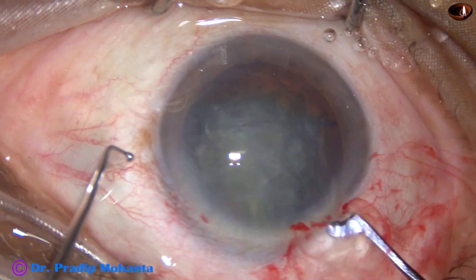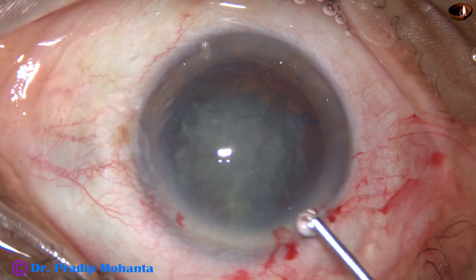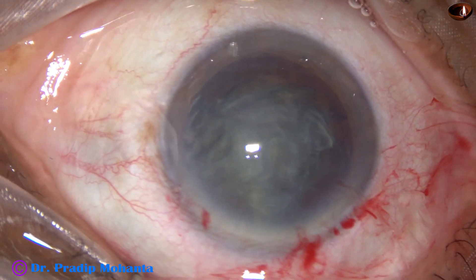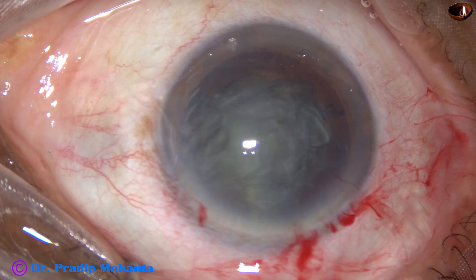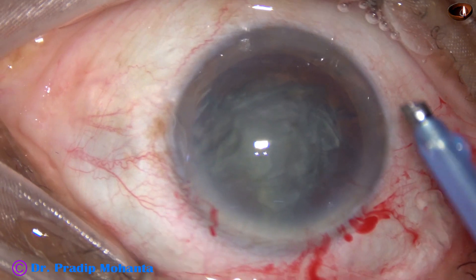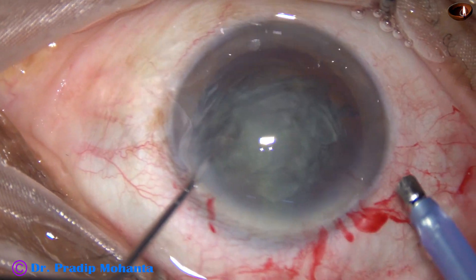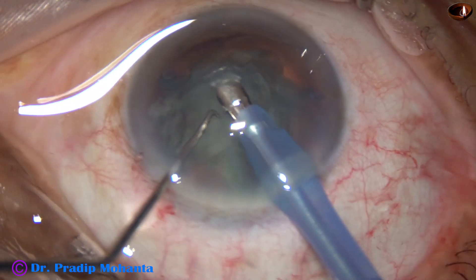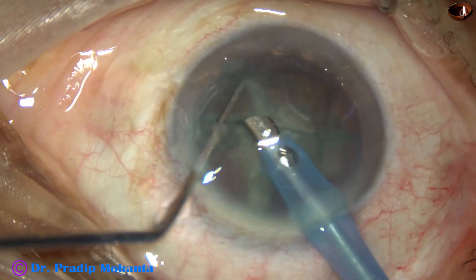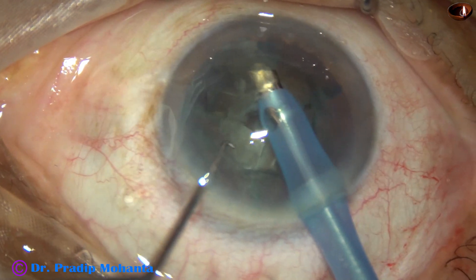If you find that the visco has come out and there is a shallow AC, you can refill the anterior chamber and again go with the pre-chopper. Now the tip of the phaco needle goes in, the superficial lens matter is removed, then the pieces are emulsified easily.